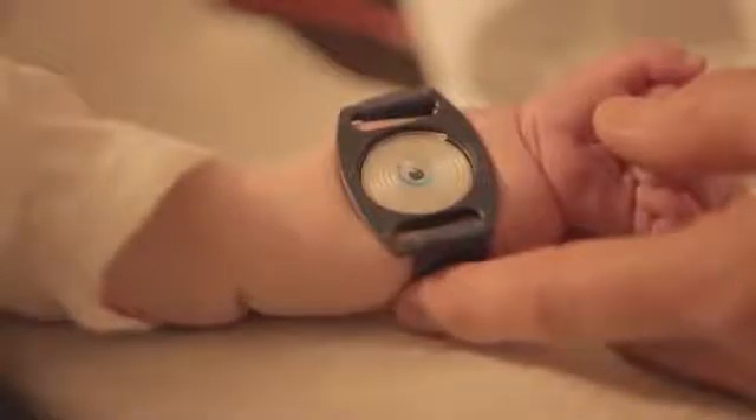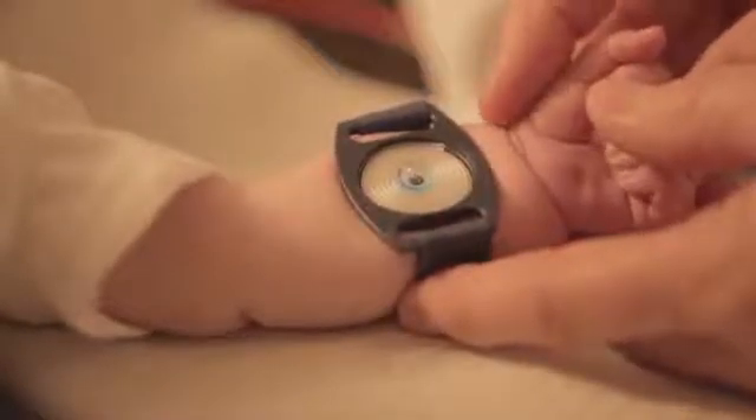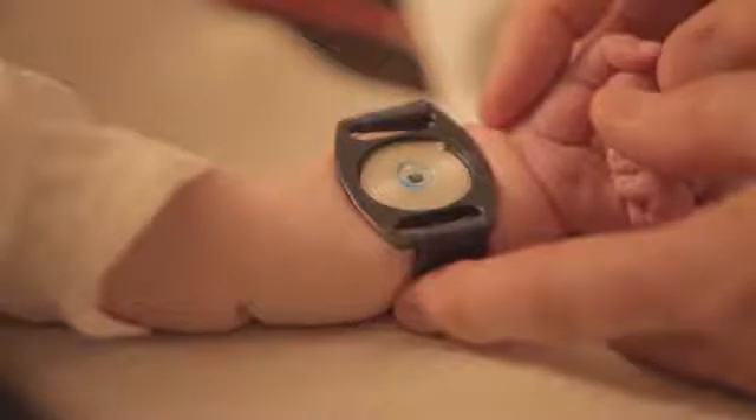The macro duct collector contains dye that will mark the sweat when it is being collected. Set a timer to leave the macro duct collector on for 30 minutes. The minimum amount of sweat for testing is 15 microliters. Some people may sweat more — if the person fills the macro duct collector before 30 minutes, the timer can be shut off and you may remove the sweat immediately.